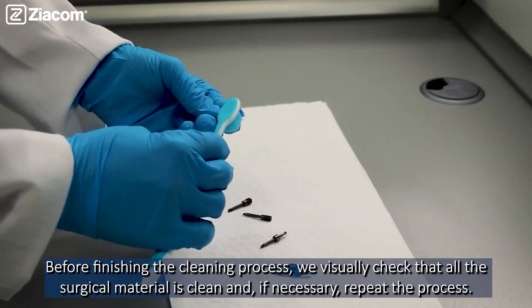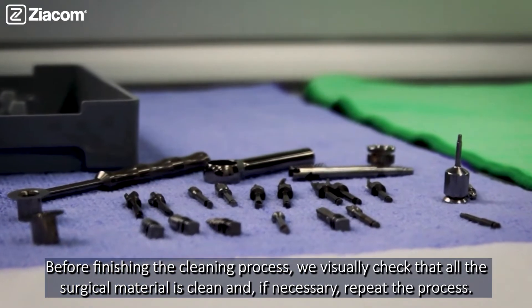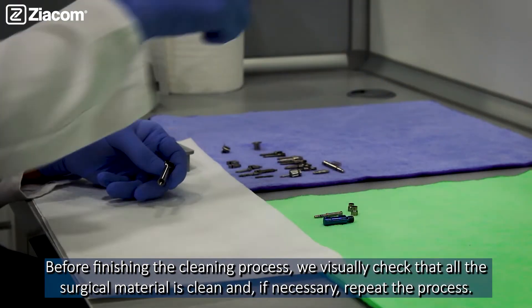Before finishing the cleaning process, we visually check that all the surgical material is clean, and if necessary, repeat the process.